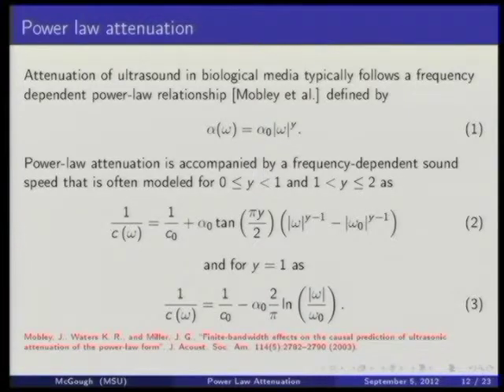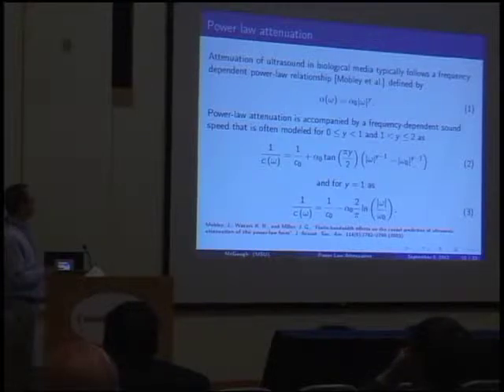So we're really just scratching the surface here in terms of what FOCUS can do, but I'd like to give you an idea of some of its capability. Now I'd like to get into models of power law attenuation. In FOCUS we can handle attenuation for the continuous wave calculations I showed you previously, but at present not for transient. This modeling of power law attenuation is part of our effort to address exactly that issue. We're familiar with power law attenuation.